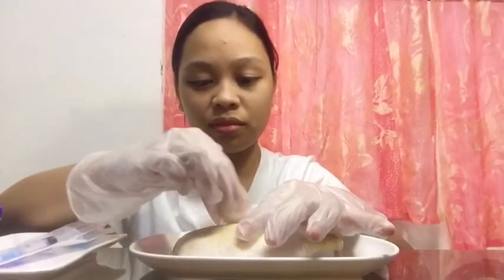Select the injection site. Make sure you are not selecting a tender or swollen site — make sure it is not hard. Apply clean gloves and then clean the site. Discard the cotton ball to the appropriate container. Wait for the selected area to dry. Do not blow on it or fan it with your fingers — let it air dry for a couple of seconds.